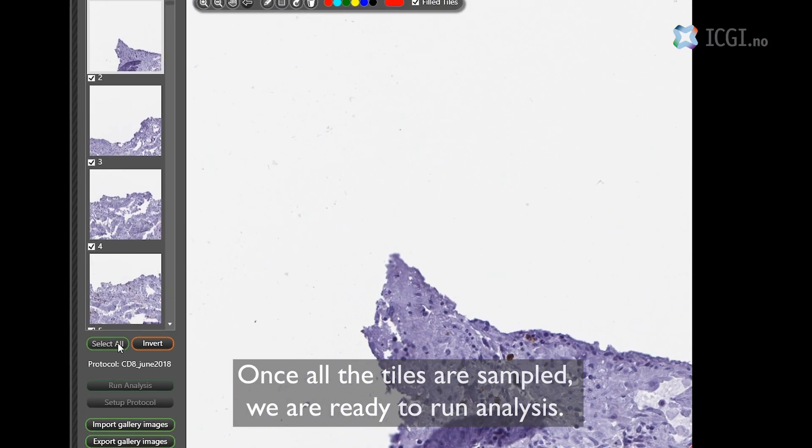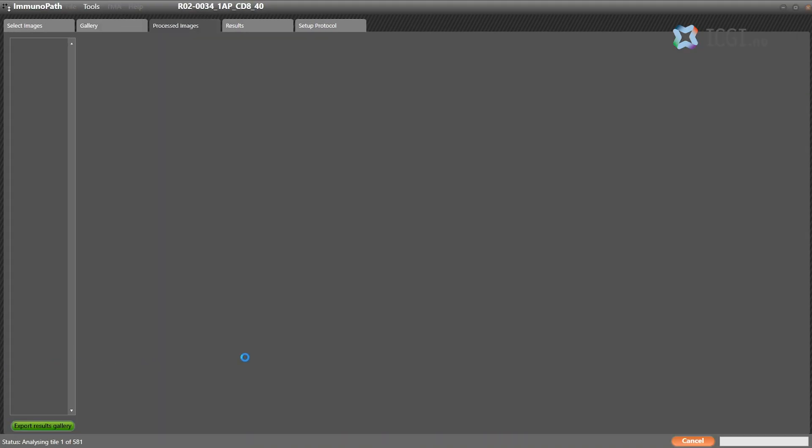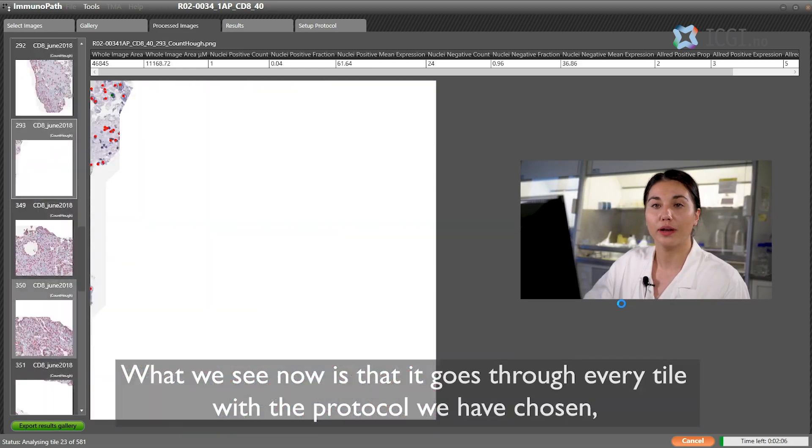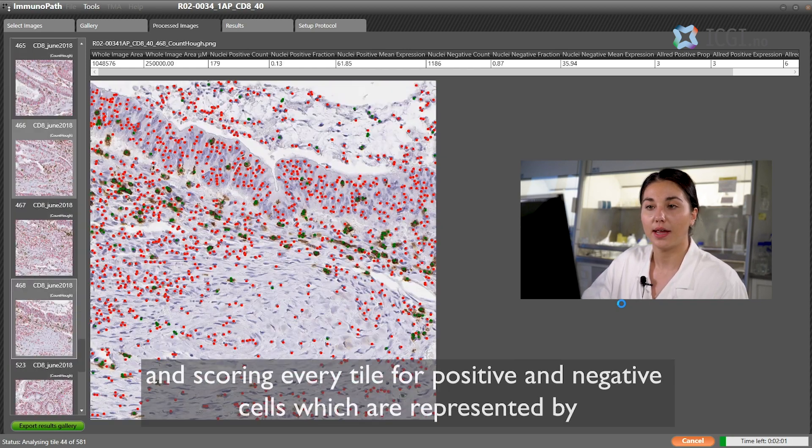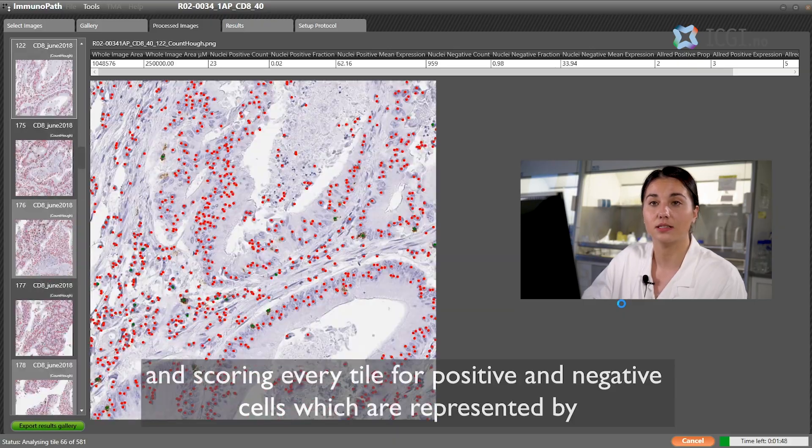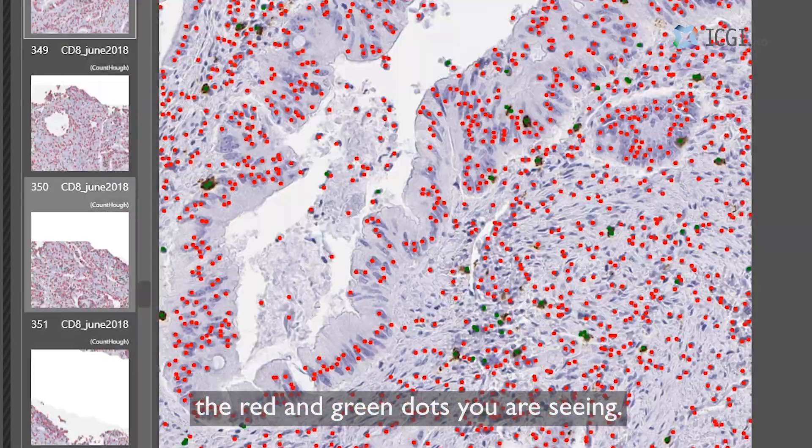Once all the tiles are sampled we are ready to run analysis. What we see now is that it goes through every tile with the protocol we have chosen and scoring every tile for positive and negative cells which are represented by the red and green dots you are seeing.